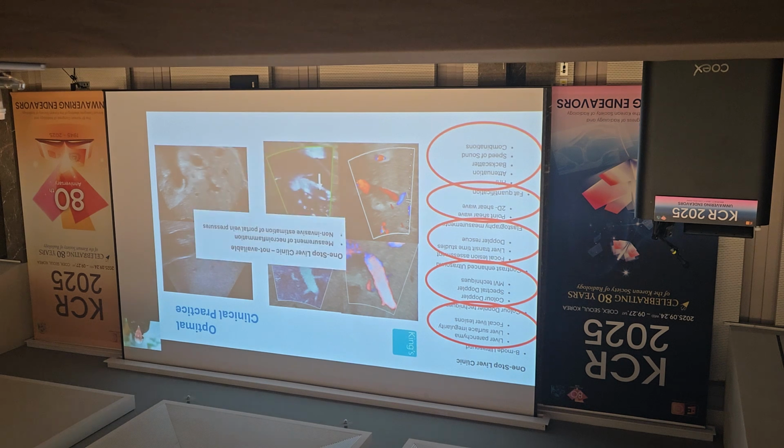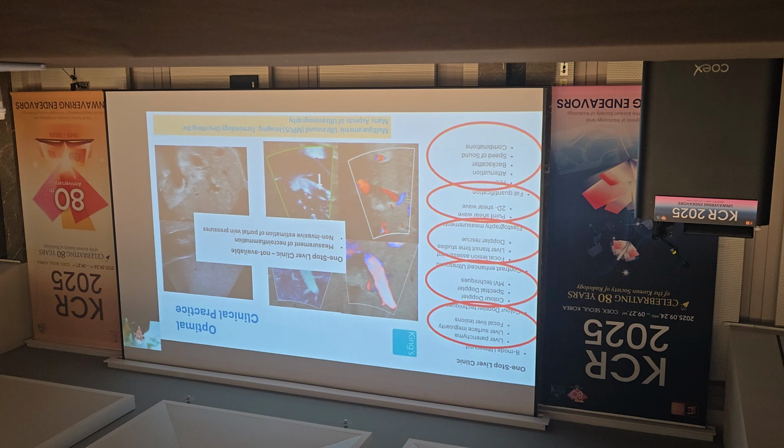20 years. So this one-stop clinic can do nearly everything, but what we can't do at the moment is have an accurate estimation, a measurement of necroinflammation. And we don't have a non-invasive estimation of portal vein pressures. Now, both of these are really new kids on the block again, but these will be coming soon to make the entire examination all-encompassing, not requiring any other parameters other than ultrasound to make the diagnosis.